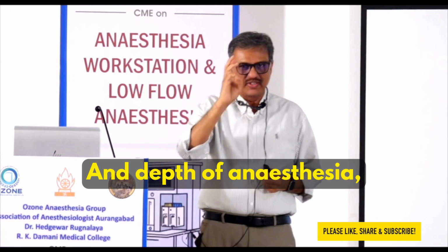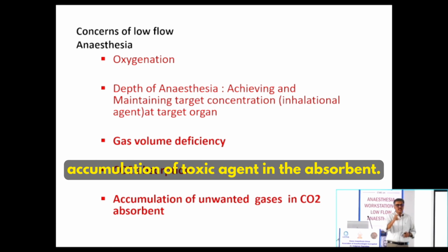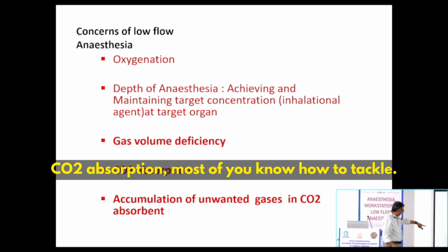And depth of anesthesia. Apart from these two concerns, other concerns are gas volume deficiency, accumulation of toxic agent in the absorbent, and CO2 absorption. So we'll discuss the first three. CO2 absorption most of you know how to tackle.